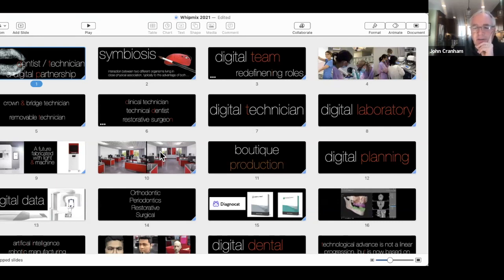And what I also really like about it is that, in the edentulous workflow, if you can reline what they have and scan that and take some pictures, once you bring that into 3Shape, it feels like you're doing a diagnostic wax up, basically. I mean, you're making basically the same decisions about where teeth will go. And so I'm just liking how all these things are interfacing in a way that is just so seamless.